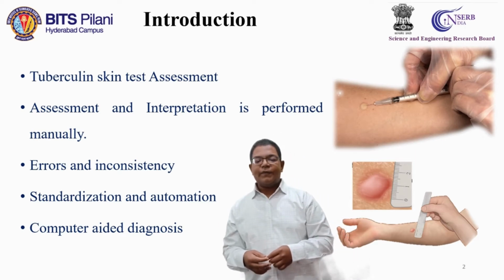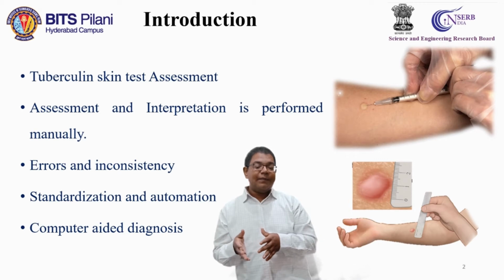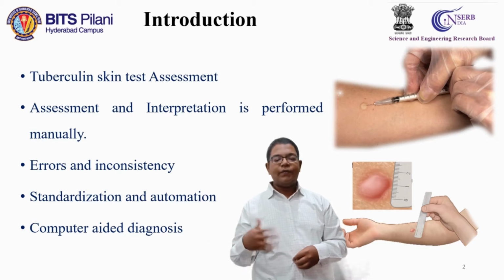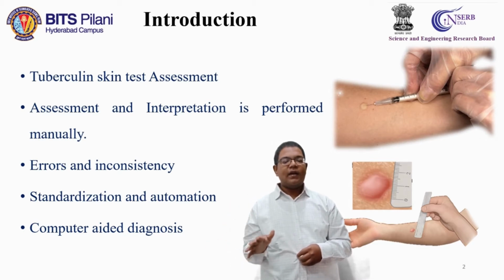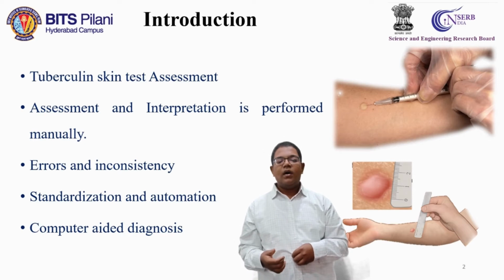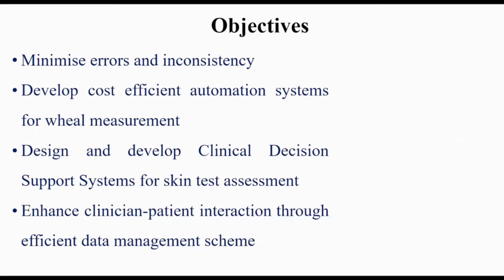From the patient's perspective, the patient can have it as a record, and from the clinician's perspective, it can be used by other junior clinicians as a secondary source of reference for their future tests. So the test results can be stored in the repository, and how this is managed in the database and how this data is processed will be shared in the next section.